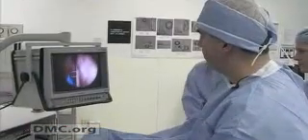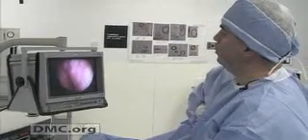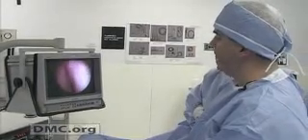It's almost miraculous. Are we looking at the prostate right now? We're actually looking right at the prostate. And instead of seeing a nice open channel, you're seeing a lot of blocking prostate tissue there. So now what we're ready to do is to use the laser beam to begin taking out the prostate tissue. The real benefit of this technology is that it doesn't cause any bleeding whatsoever. You shine the light on the prostate and the prostate disappears, kind of like science fiction.